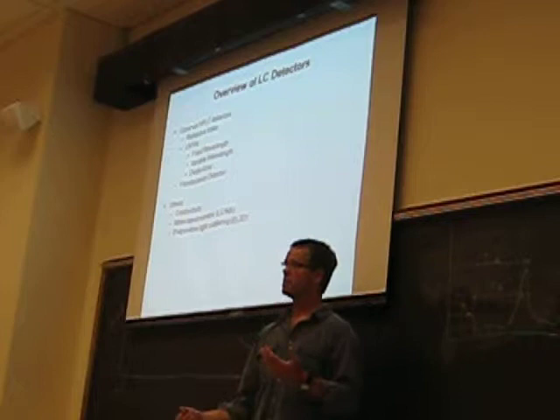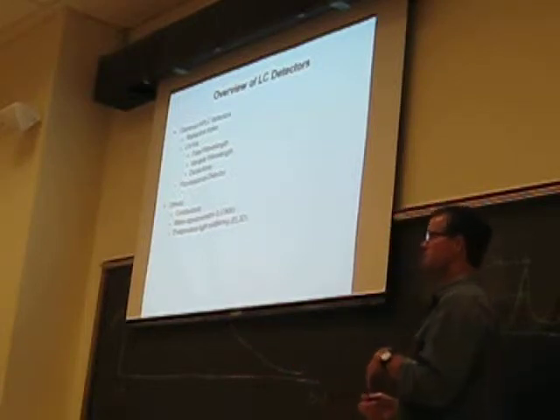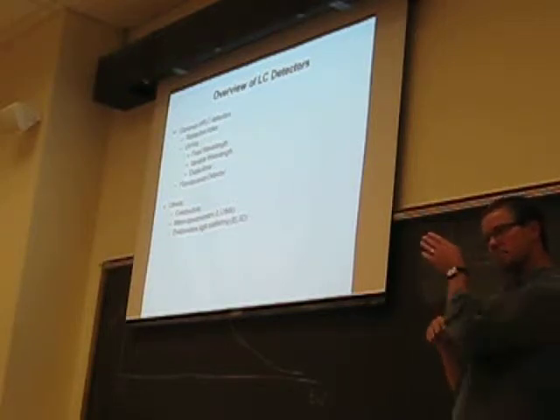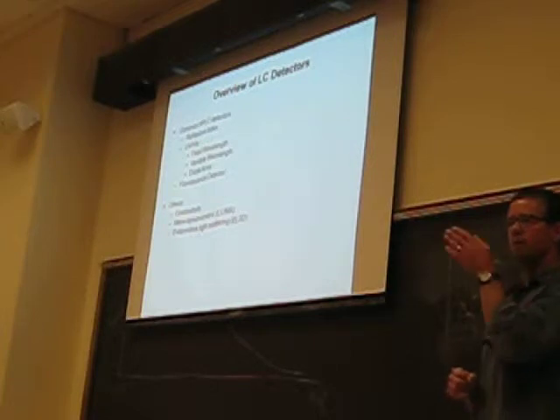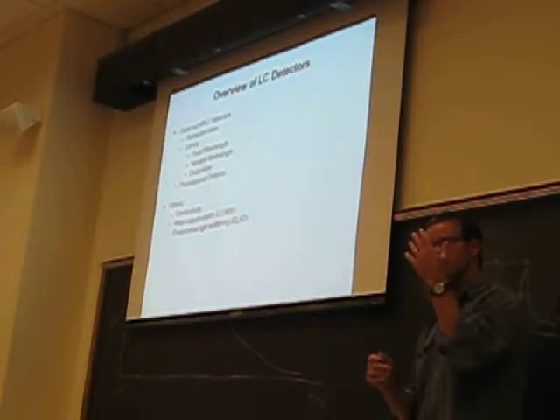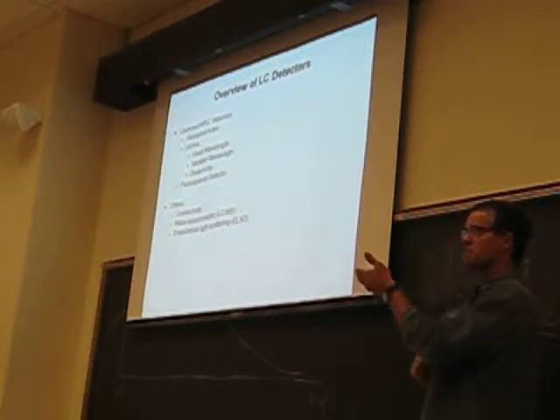And so we've done a lot of methods where we developed methods because we were interested in understanding the speciation of arsenic in human urine samples. If people get exposed to arsenic, in groundwater or whatever, they metabolize that. Some of it remains as inorganic arsenic. It goes from arsenic 5 in the environment typically, gets reduced to arsenic 3 in your body, then it gets converted into different organic forms of methyl arsenic, monomethyl, dimethyl arsenic, other different kinds of organic species of arsenic. And each of those kinds of species tells us something about the potential effect of arsenic in the person.